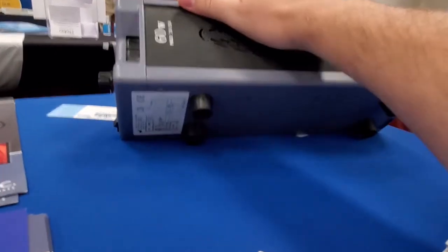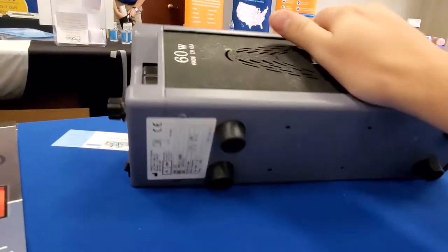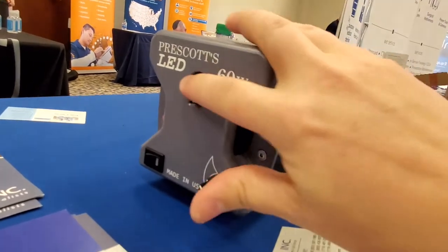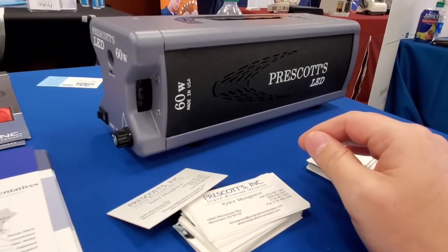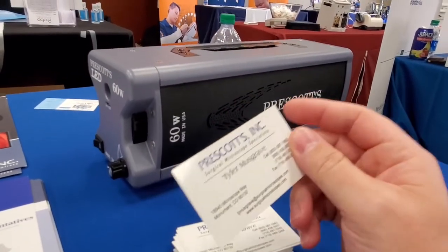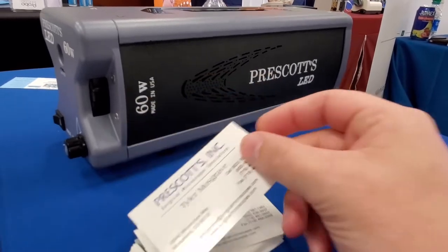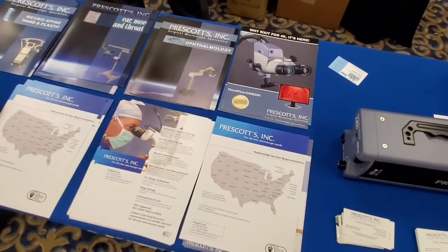There are going to be some mounting options for retrofitting your microscopes. But since this can handle a variety of light cables, you can also use it as a regular light source for operating rooms or small procedure rooms. Very cool offering — who would have thought Prescott's would offer an LED light source? This thing looks like it's built to handle anything. Here's Tyler with his contact info. Was not expecting that — so that's Prescott's. These guys no longer supply just parts; now they manufacture devices.